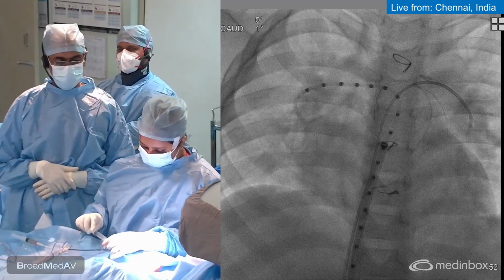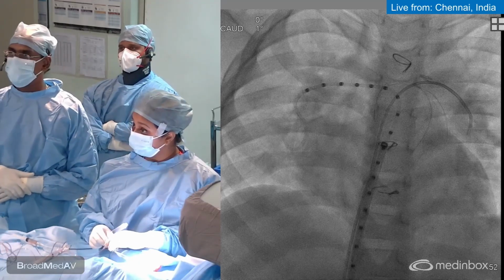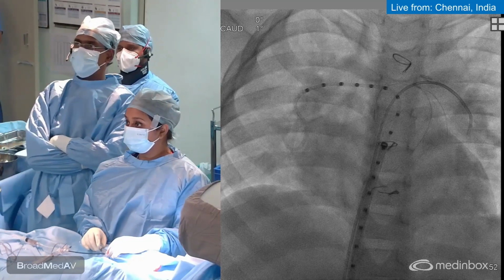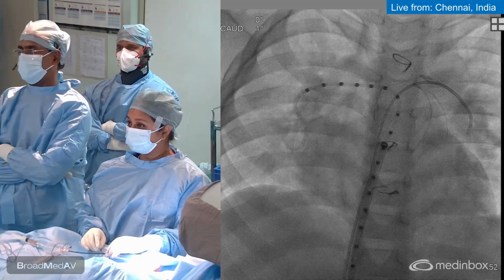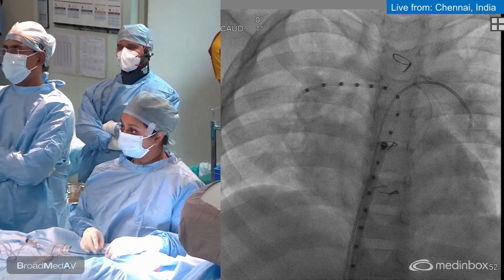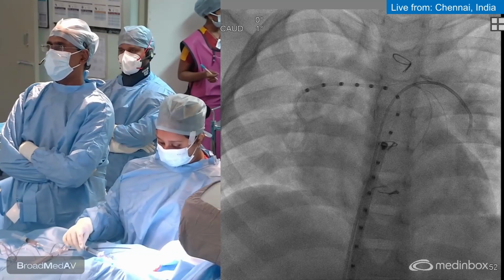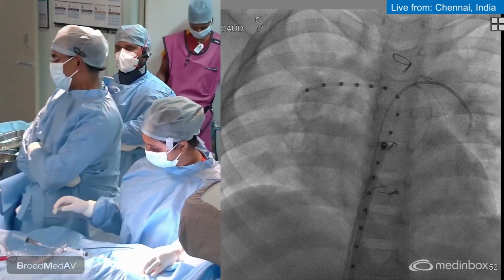So this is a comparison of the aorta to the right ventricle. The aorta is about 20 millimeters more. The right ventricular pressure is coming close to the aortic pressure. And the aorta, as I speak, is around 105 or so, and the PA is around 85. So it's indicating that the RV pressure is quite significantly elevated.